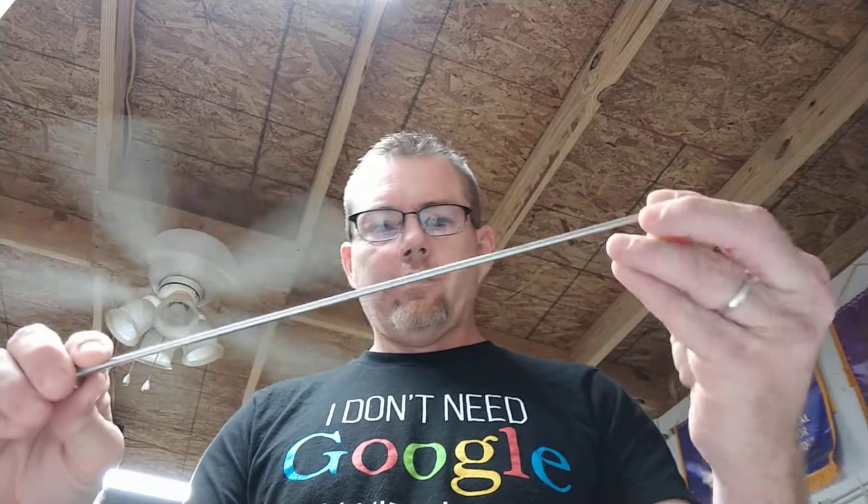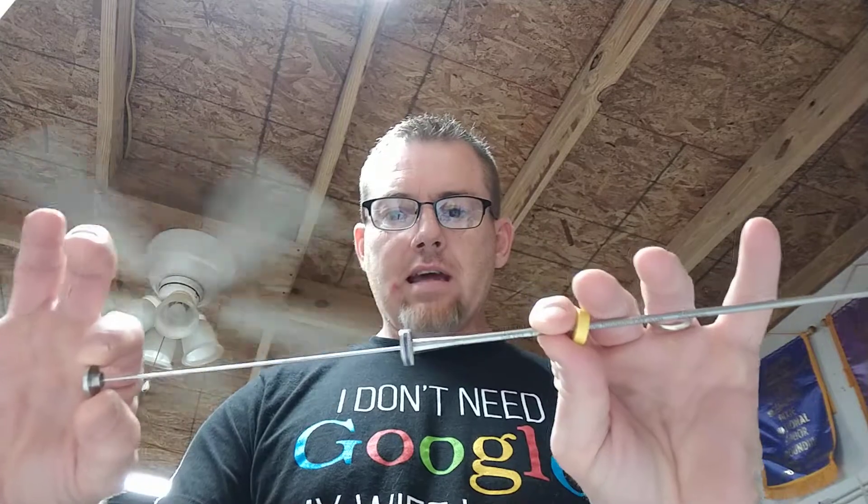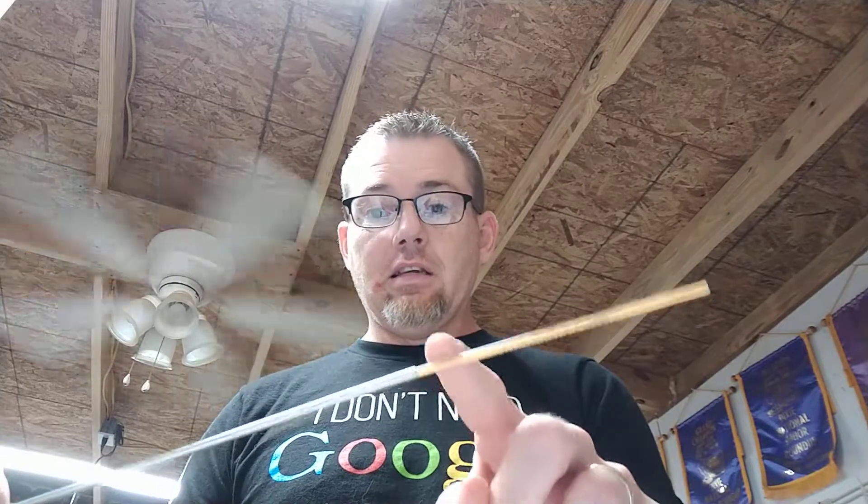Alright, so we're gonna teach Brenda how to load this thing up properly. We got a plunger — make sure the little donut's on there, pull the plunger back, and load the cotton piece in first. On this end of course you should know that, and you already clipped off the cotton side.